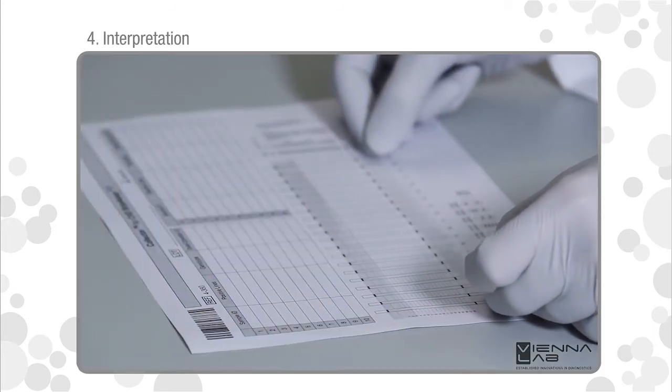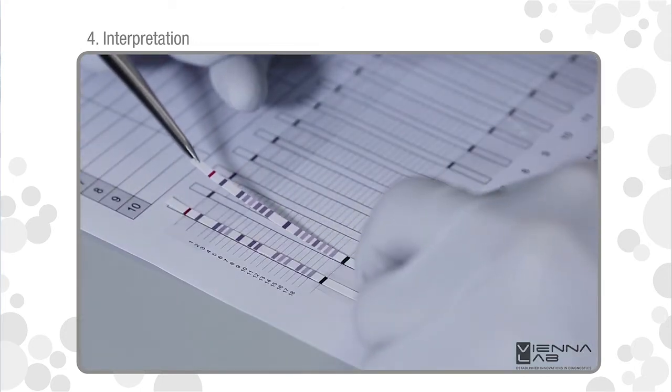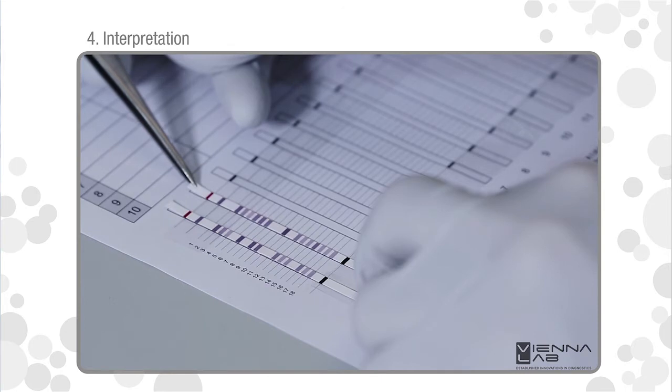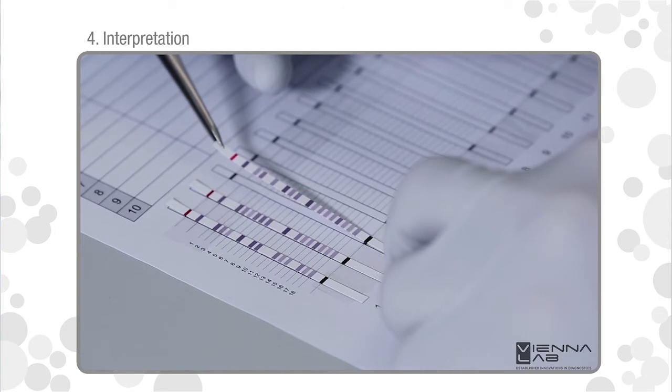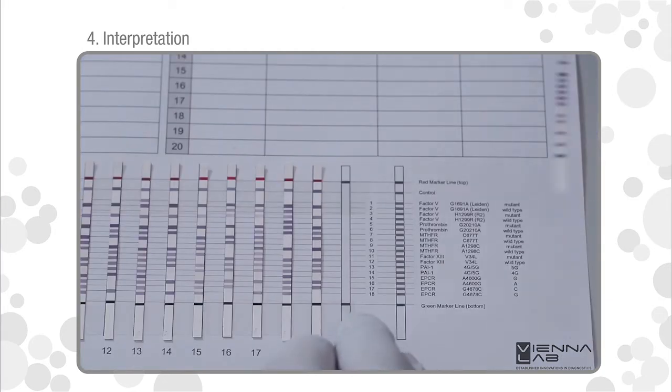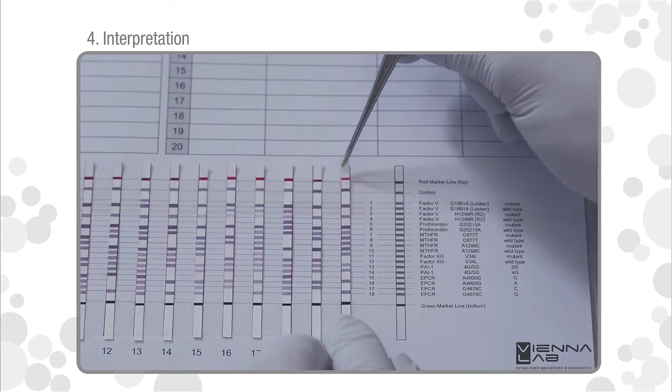Use double-sided tape to fix processed and dried test strips into the designated fields of the collector sheet. Align test strips to the schematic drawing using the red and green marker lines.